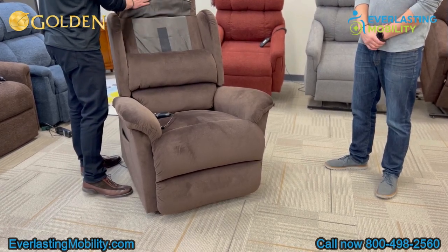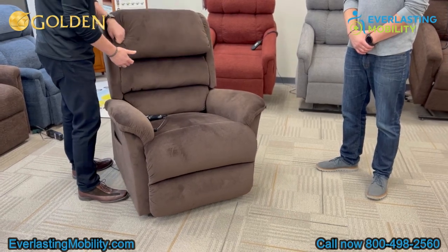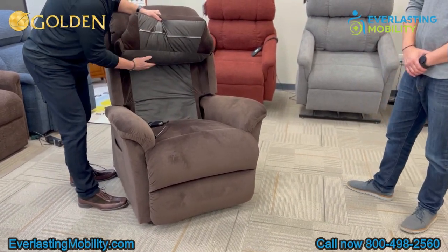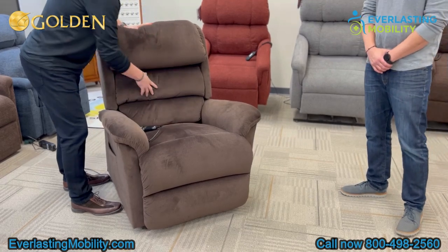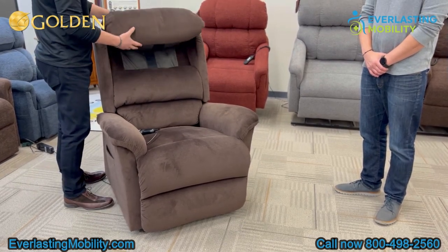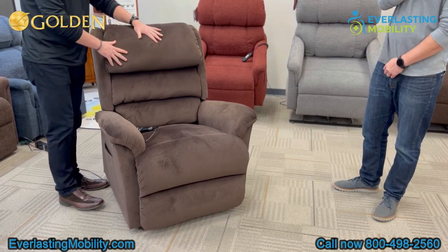Each pillow has its own zipper in the back. You can open it up and add or subtract Dacron depending on how much support you want. These pillows have individual zippers — it's a great way to add lumbar support if you'd like more. Some people take the top pillow and actually remove the Dacron and put their own goose down pillow up there to get that goose down feel.